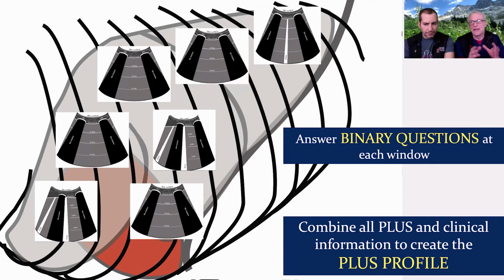Okay. And then if you look at the human literature, we don't have the exact numbers yet in the veterinary side, but generally speaking, if you've got more than 2 sites that are positive on both sides of the chest, it's pathologic. In humans, for alveolar interstitial. And that's the consensus on the human side. And we have a similar consensus on the veterinary side. More than 2 sites on both sides that are positive, that's pathologic.